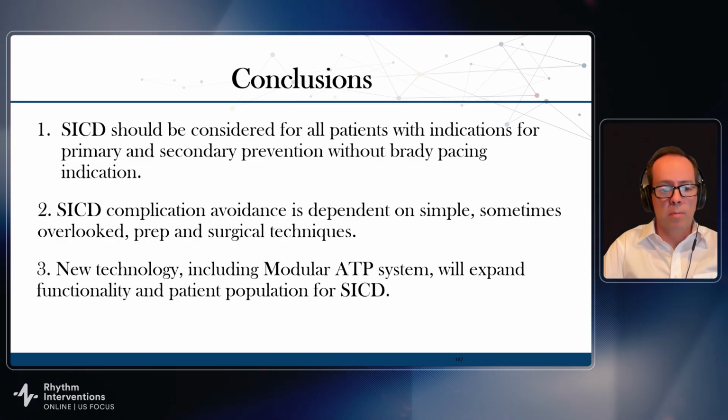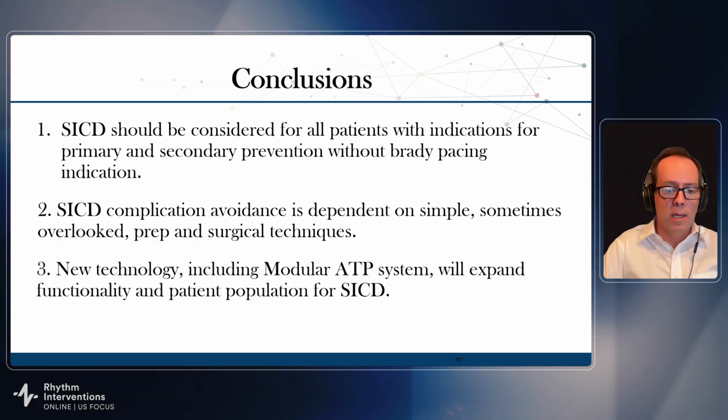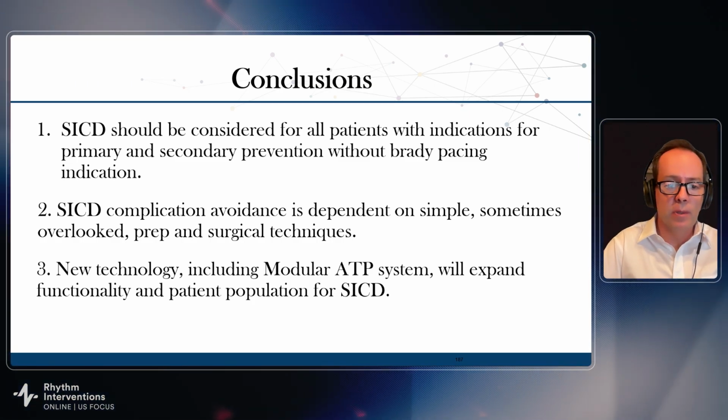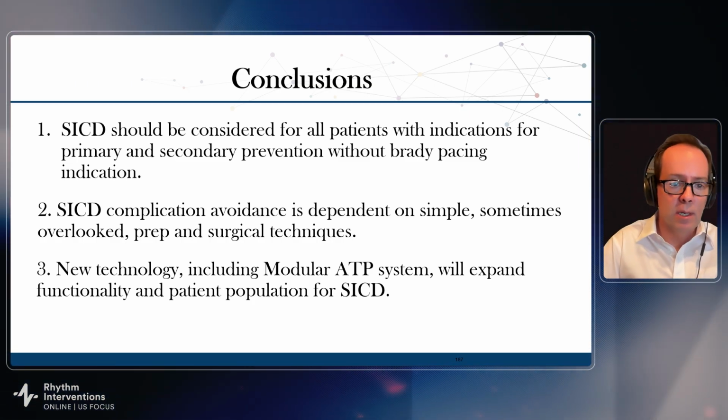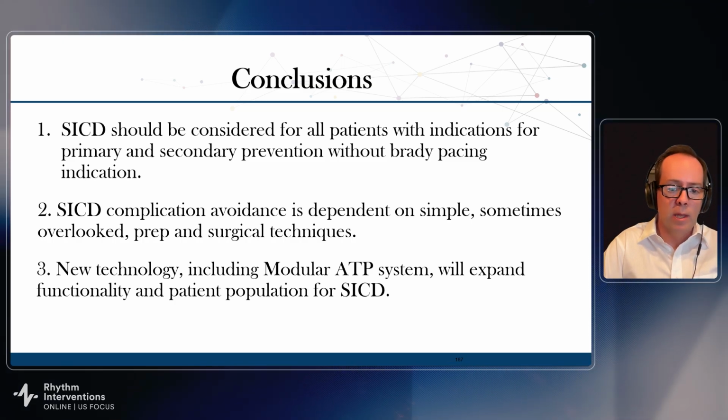So there's our implant, some tidbits pre and post. I think the reason why we're all talking about this and why this has been featured in this RIO Congress is that all patients with indications for primary and secondary prevention without bradypacing indication should be considered.